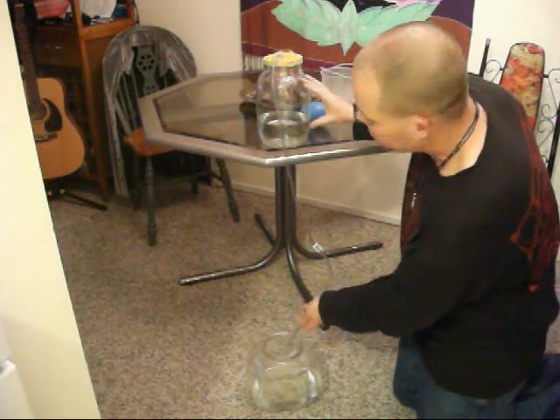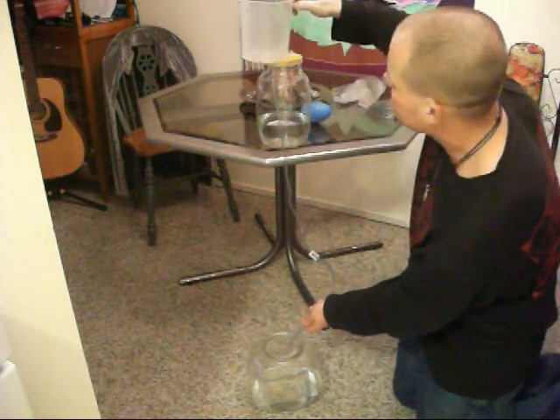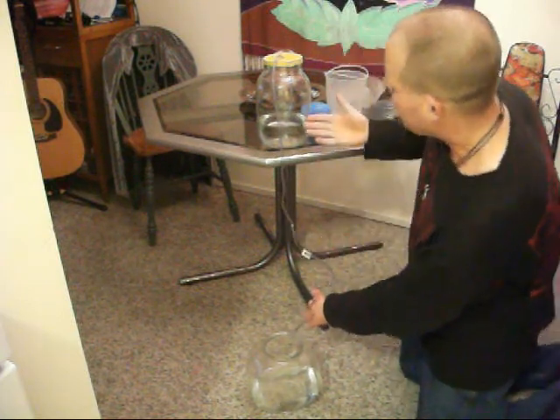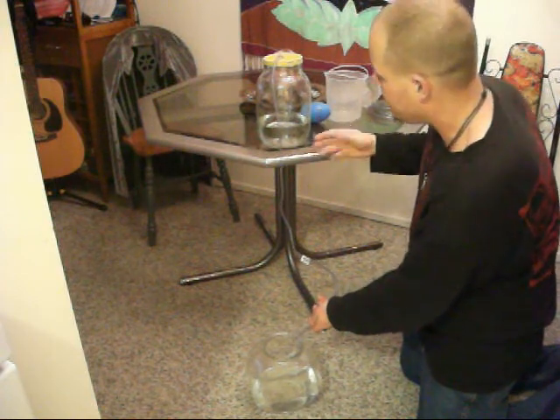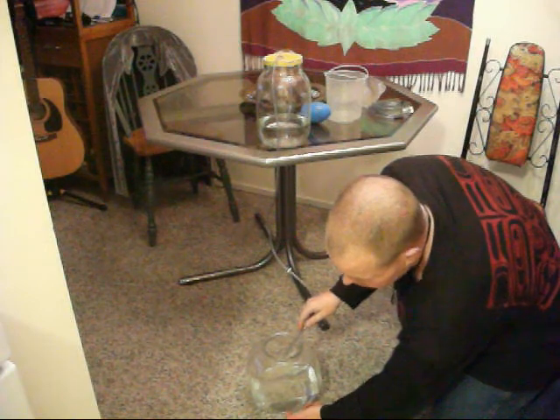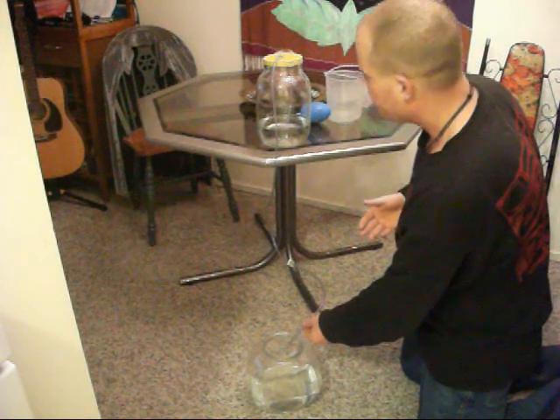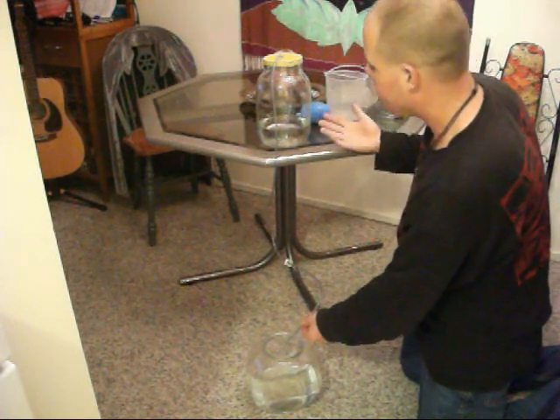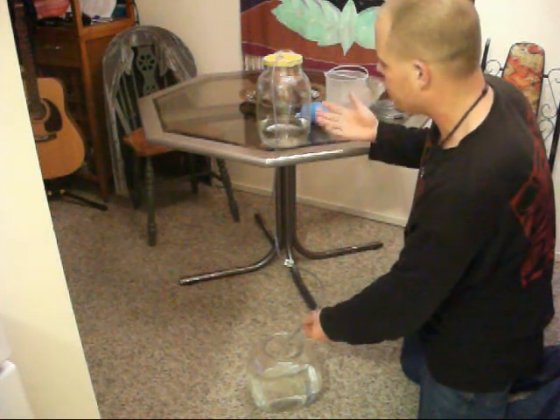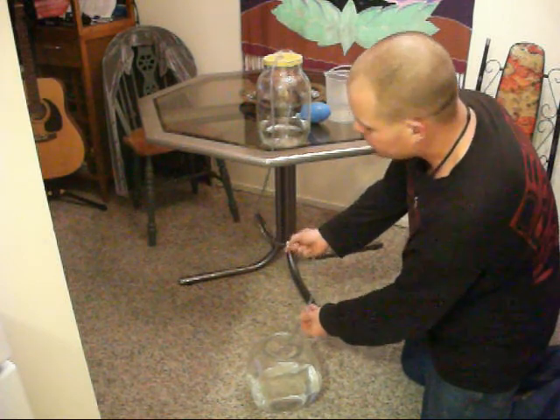So if you want to do a full enema in one shot, that's 4 liters. That's basically 2 of the regular enema buckets. And this is your homemade glass version right here. I came up with this. Originally I was thinking of drilling a hole and having it come out the bottom, but ultimately the siphoning works just fine. And then you can use the jar for other things as well, as long as you're doing Rejuvelac or kombucha or whatever, drinkable stuff. And so it could be reversible too.